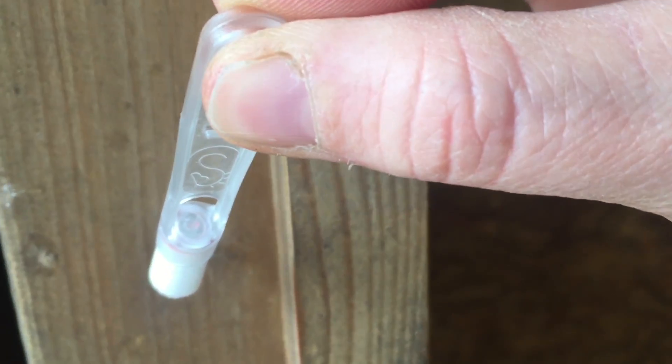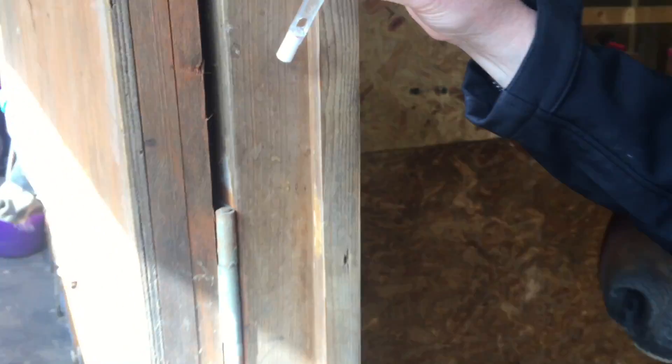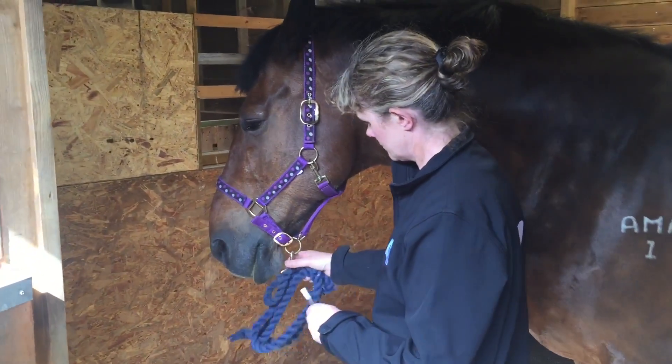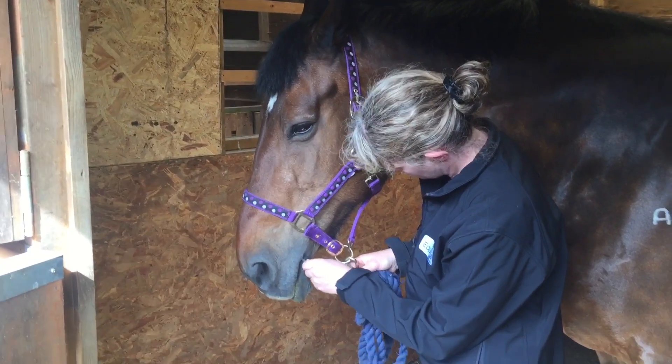At the start of sampling the colour change indicator is white. Holding the ridged plastic end, the swab is inserted in the side of the mouth through the interdental space between the front and back teeth and on top of the tongue.